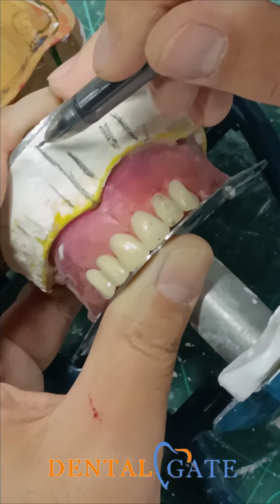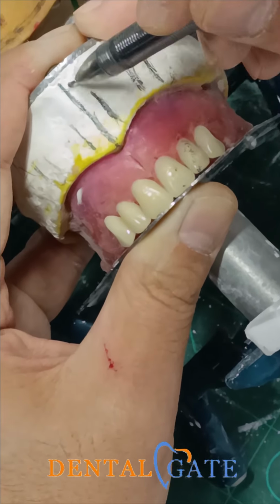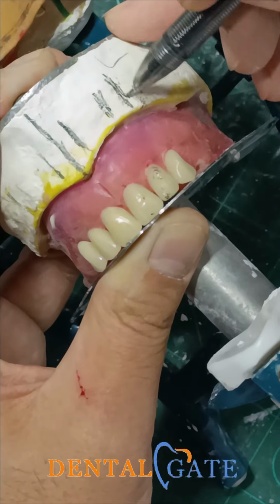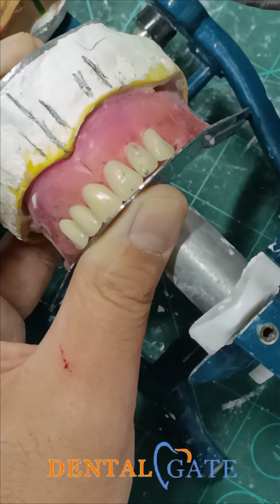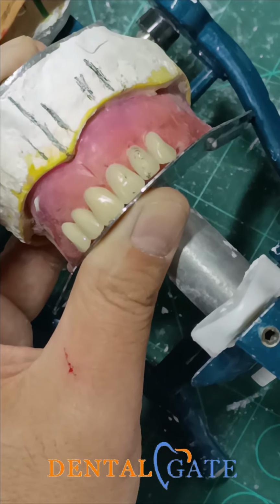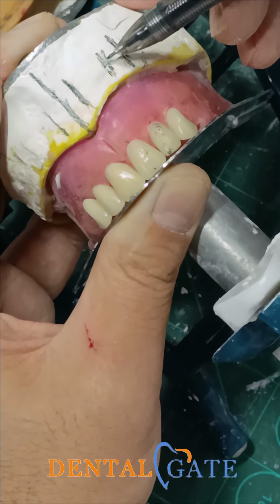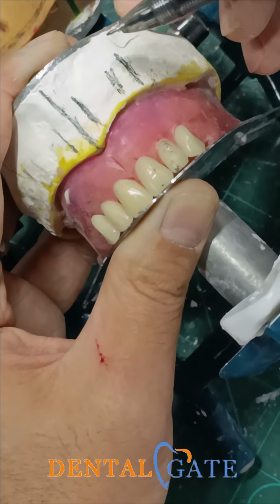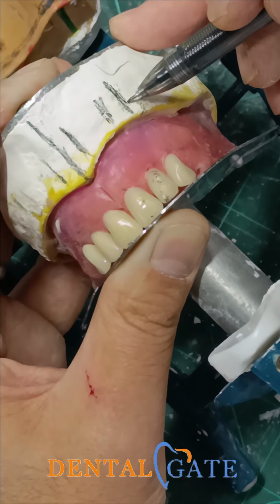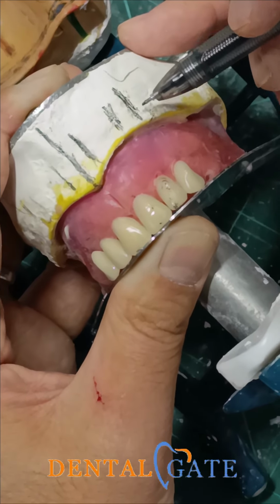It will be parallel; this is a vertical axis. There is a long axis, a vertical axis. The long axis should be parallel to the vertical axis. Make a revision, there is no inclination here. If you want to make an inclination here, my recommendation, don't make it, okay? For the canine, don't make any inclination.